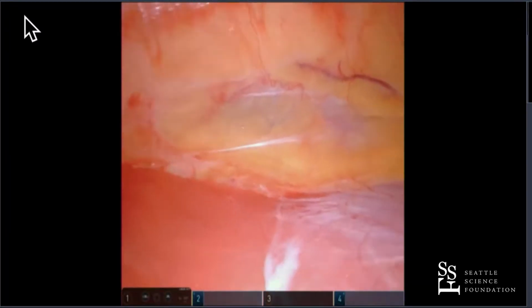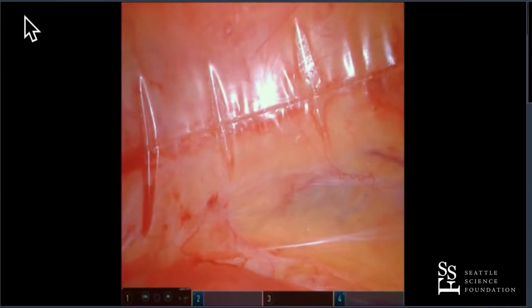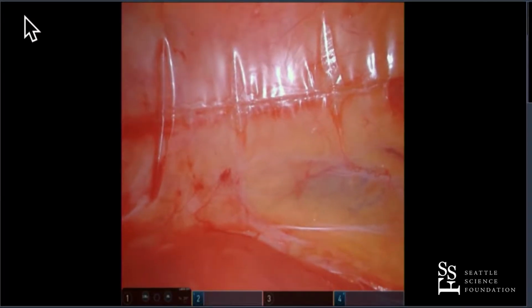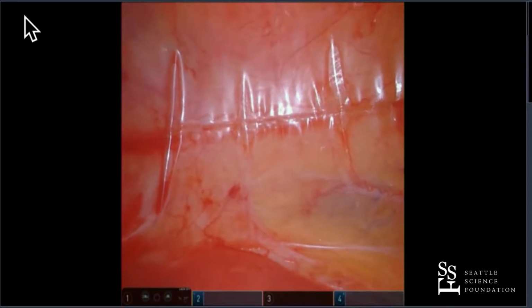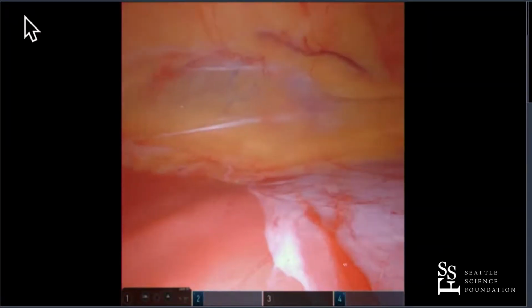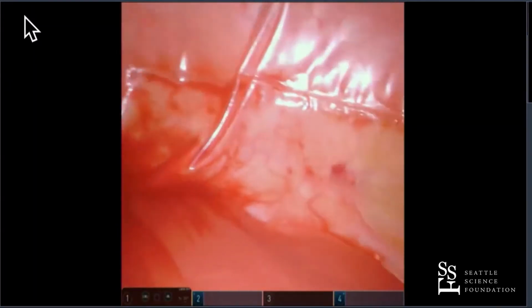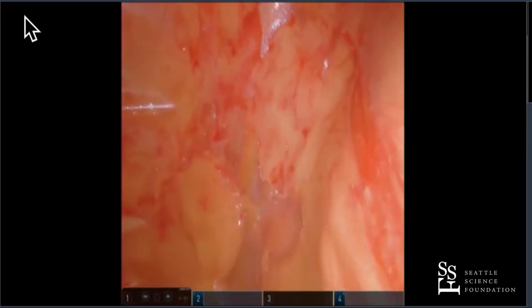If you make a hole in the peritoneum, that's what a lot of people ask, what do you do? What I do is I make the hole extremely large, and then I put my fourth arm instrument basically transperitoneally, bring the instrument through that hole, and then use it to hold the kidney and the peritoneum back. And that's actually how we started using the fourth arm with the Si. When we made holes, we would bring the fourth arm in because we had enough space to do it, and that helped. Go ahead, Brando, give me a couple more. I want to see if we can get this peritoneum off, or if we can at least show it.